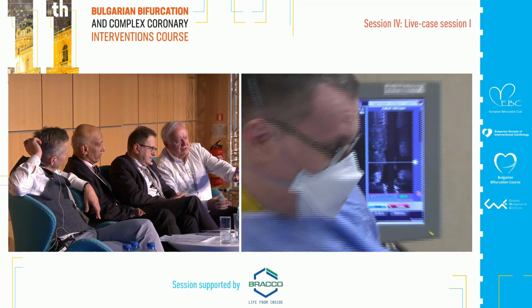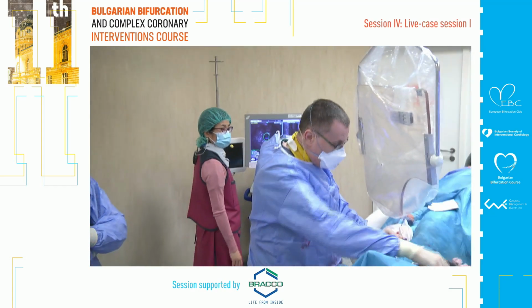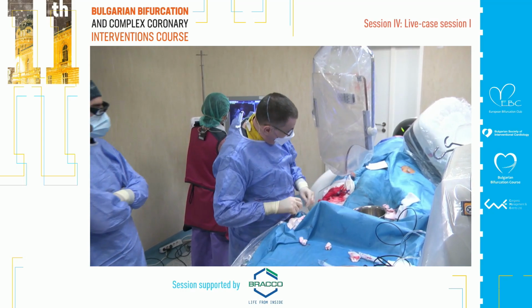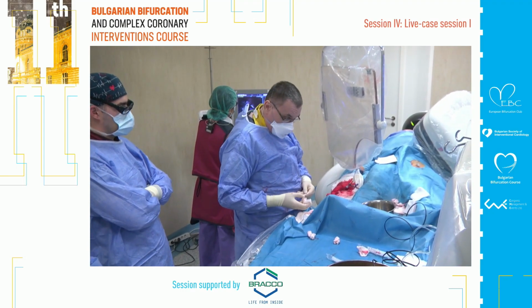For me, probably this is a sign that I pushed it. I should not have touched it enough. There is room there. Absolutely, no, you shouldn't touch it. For me, don't touch.